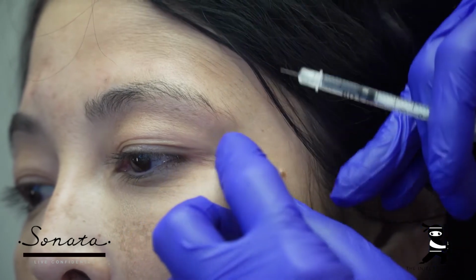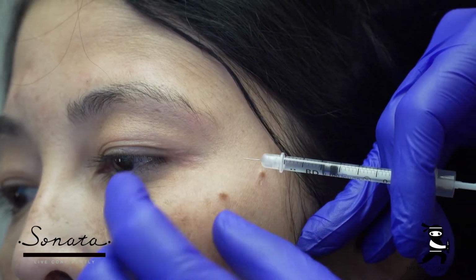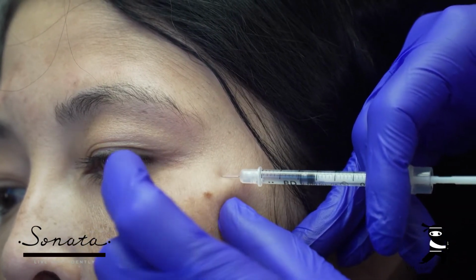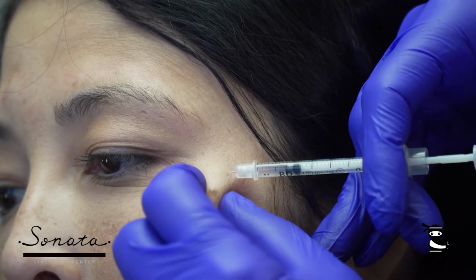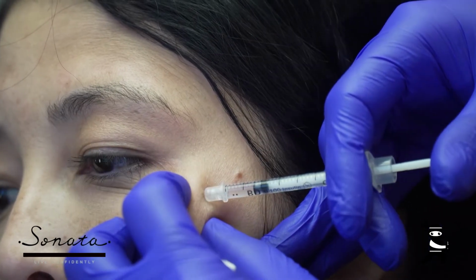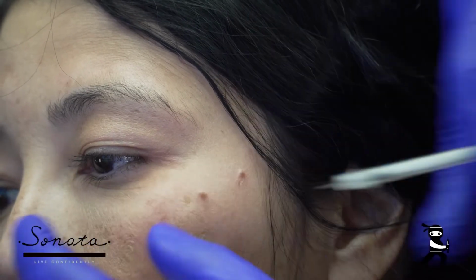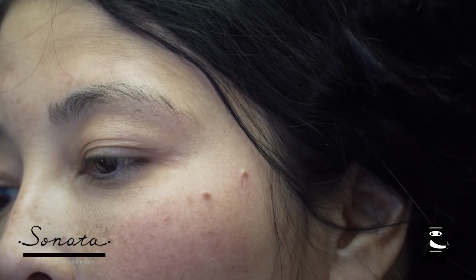So with the crow's feet, I like to also use distraction techniques, either tapping or wiggling the skin or moving the skin toward the needle. So again, we're just going to touch the needle to the skin. We do a two-handed technique where we're moving everything toward each other. Another poke, like this. And then right hand moves quickly, left hand taps or moves the skin.